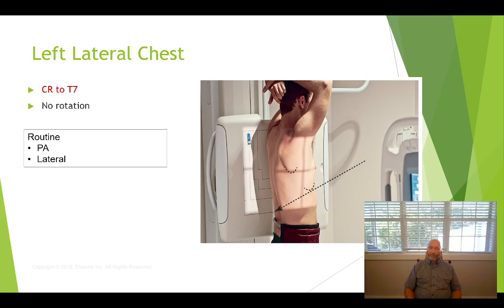And that's really kind of what we want, because the right lung naturally is not as long as the left lung in normal anatomy. And that is because of the placement of the liver. The liver, primarily being on the patient's right-hand side, has that right hemidiaphragm elevated just a little bit. So that whenever we position the patient in the left lateral, we get 2 things.